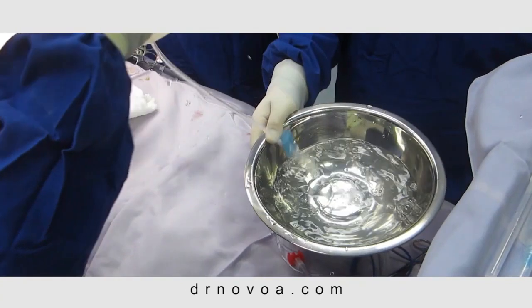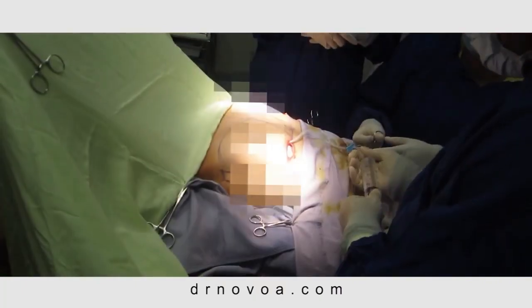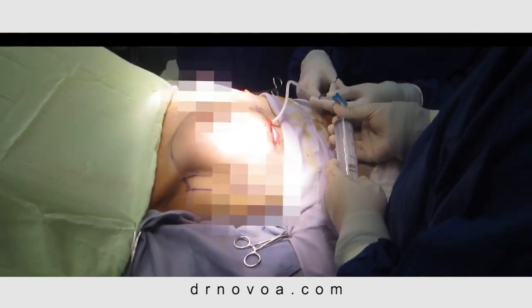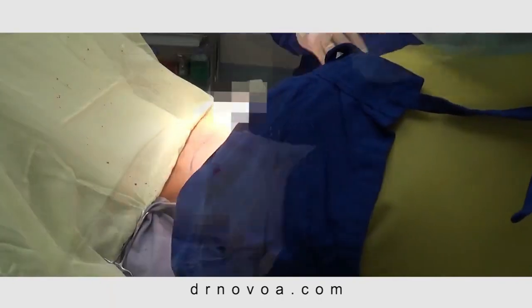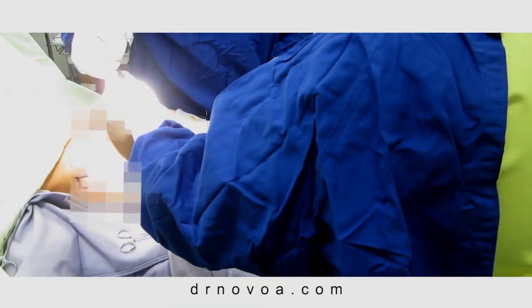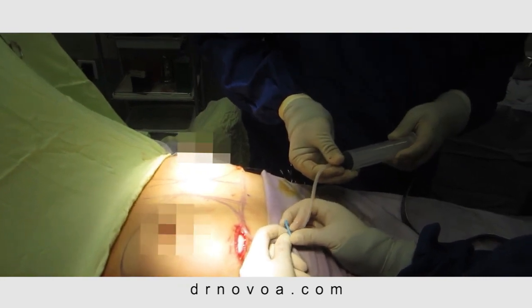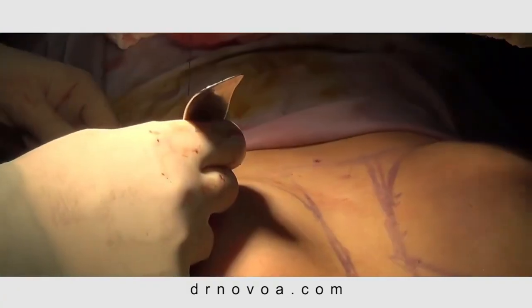An implant sizer is inserted and the pocket boundaries are determined. A larger sizer is exchanged based on the estimated pocket capacity and inflated. The pocket is then irrigated and the supporting sutures are then placed. Based on the capacity of the implant sizers, style 45 600cc implants are chosen and then inserted. The incisions are then closed using absorbable suture.